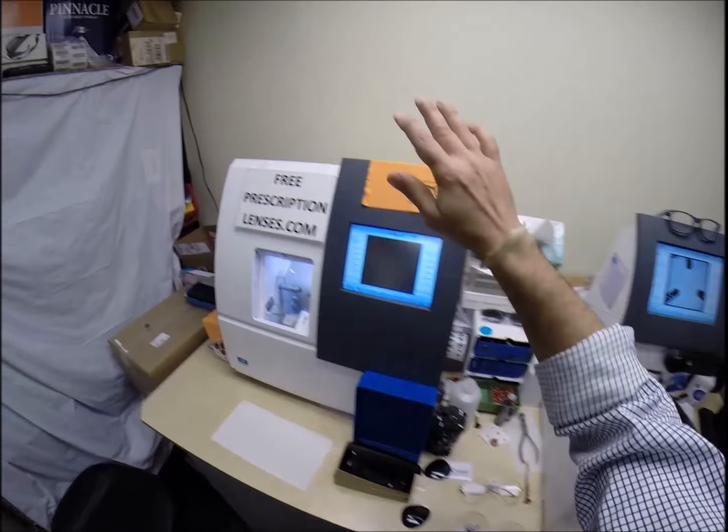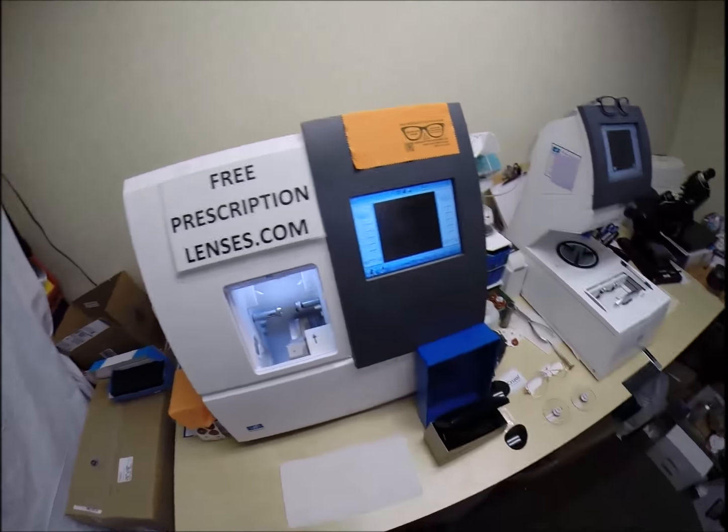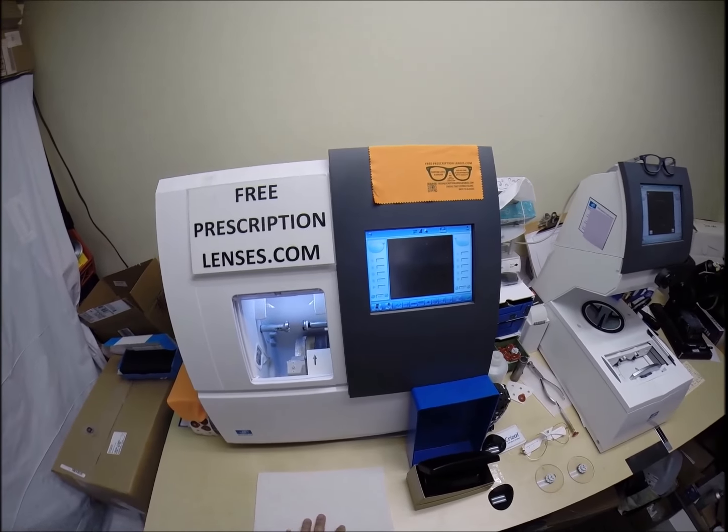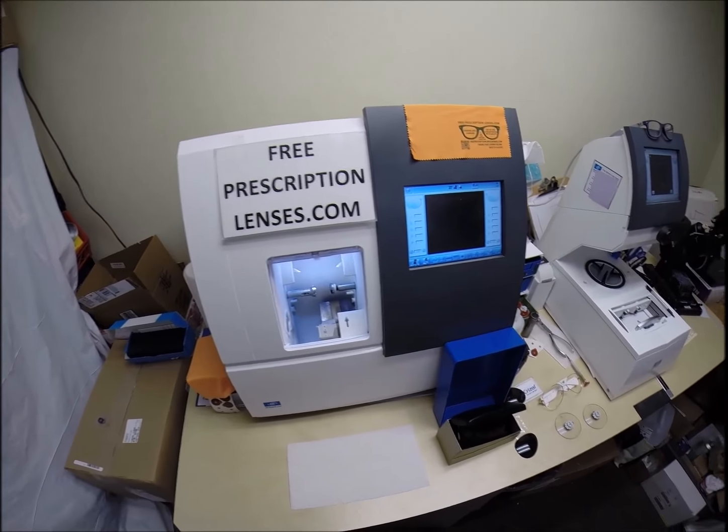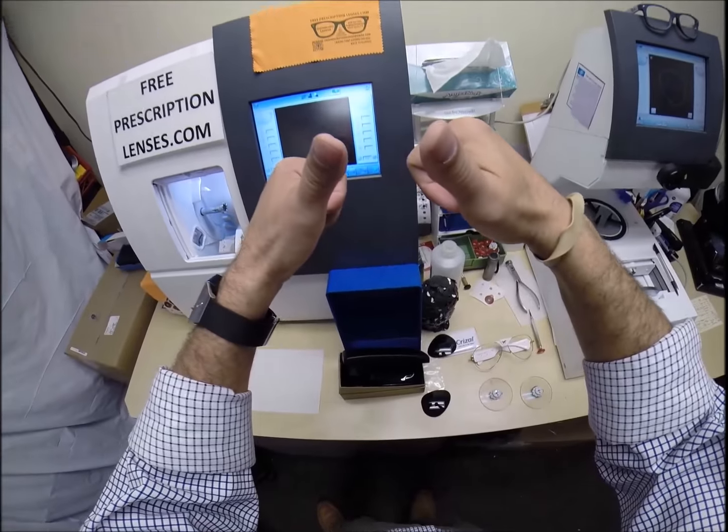Now this is the edger. This is what's going to do all the work while I run my mouth. It costs $40,000. It weighs 200 pounds. I recommend everyone go out, buy their own, put it on your kitchen counter, and then you can cut your own lenses at home, and you won't need this guy with the two thumbs and the bad jokes to do it for you.